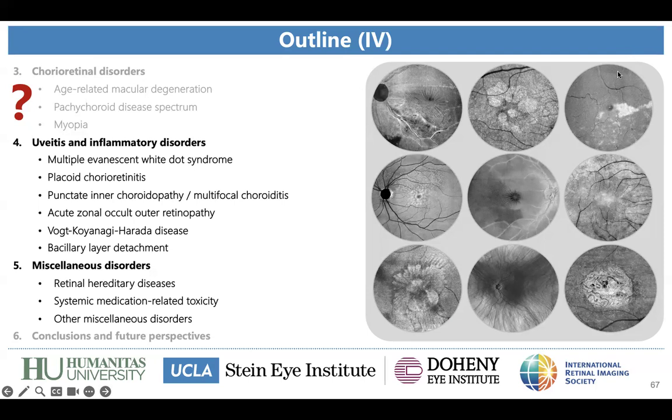Thanks so much, Ricardo. Great point. Actually, the main paper that I know about is the paper by Pichi and co-authors that I showed you. But I think it is very important, as Luis was also mentioning, to study these alterations longitudinally. So actually, I'm looking forward to the paper. Congratulations to you and your fellow on this work, and I'm very excited to read about it. I think it's a great point to correlate the hyperpermeability with en face OCT choroidal maps, and it will be very useful to non-invasively monitor these patients.